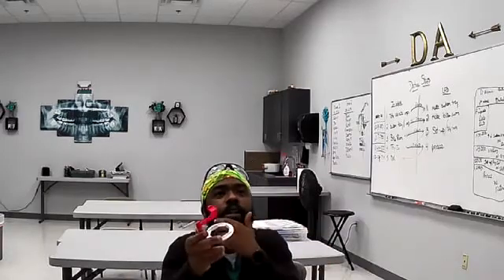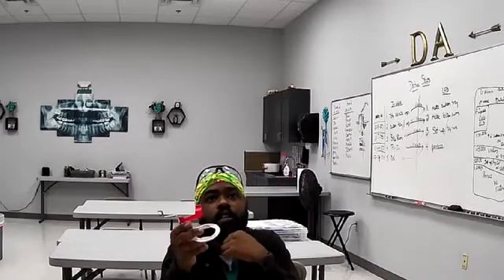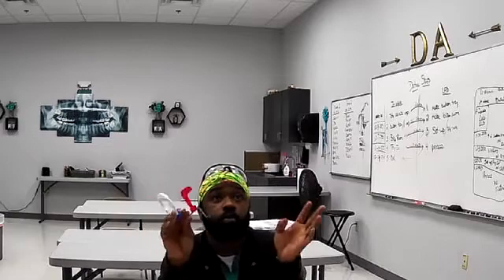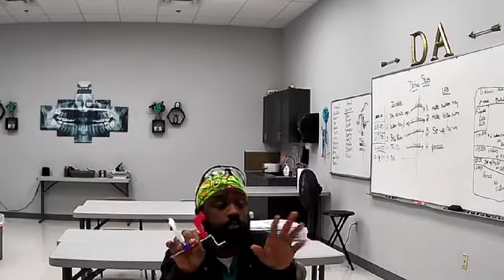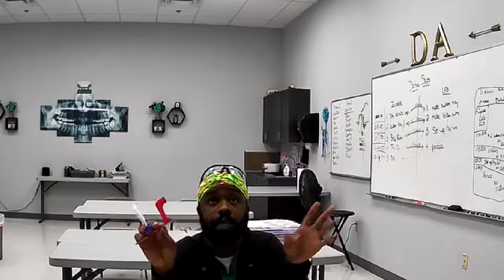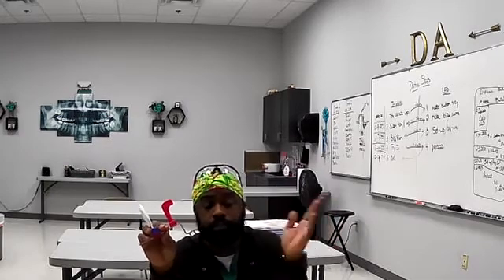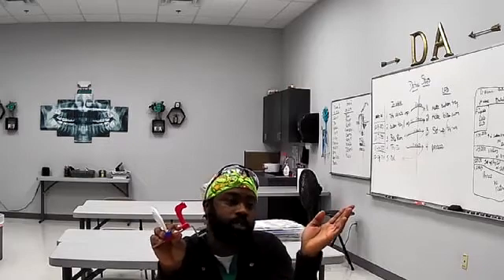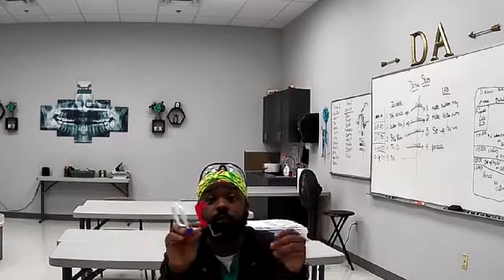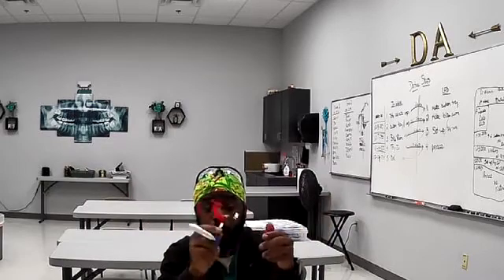The bite wing is used to look at a specific area of the mouth. Your dentist may request one or multiple bite wing X-rays during the checkup, and that's fine. Most of the time, I go ahead and get one in the beginning. I'll check the history. I will check insurance claims to see if we're allowed to take another bite wing.